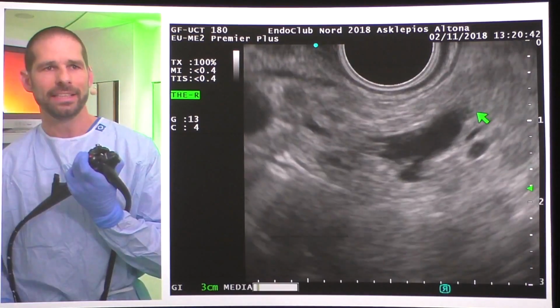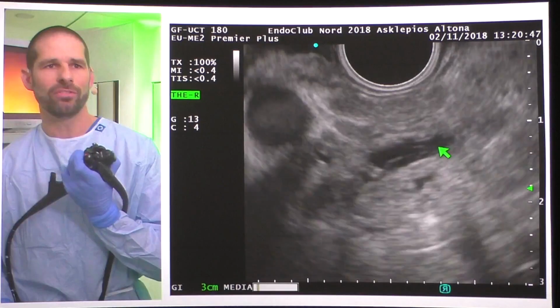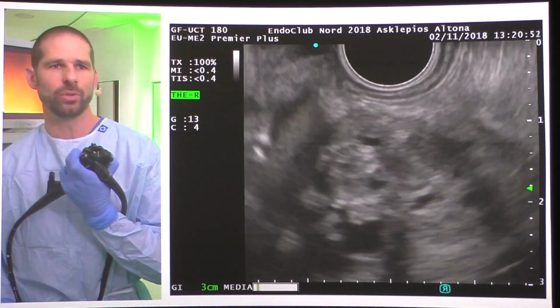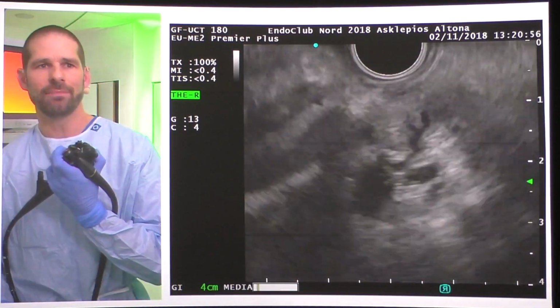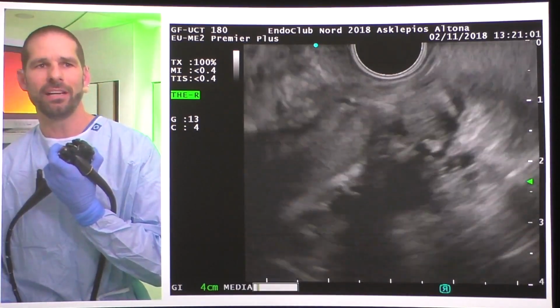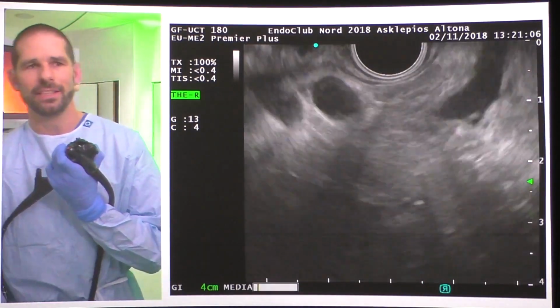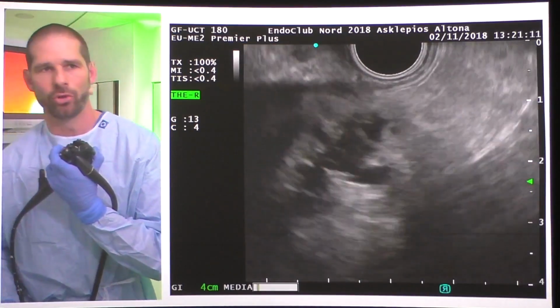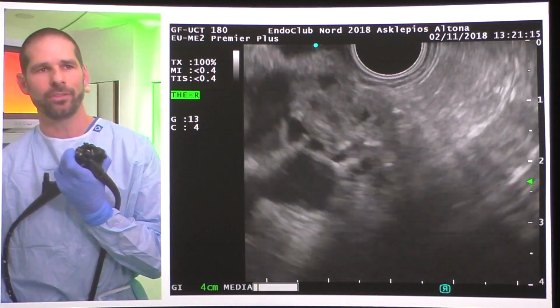So you see the dilated normal duct, then there is a brief distance where it narrows, and there is a strange wall structure, slightly stronger, and then the parenchyma becomes irregular. And on the bottom you see cystic parts, and after this short narrowing, the duct is wide again. In the tail, there seems to be an abnormality. We don't see a delimitated tumor, but it is a little blurred.